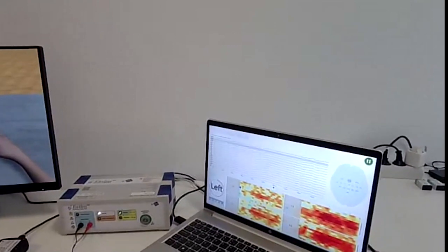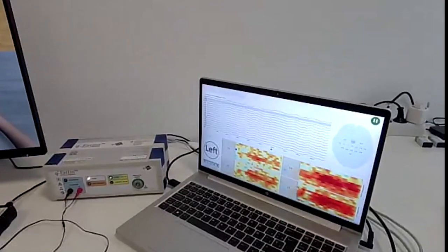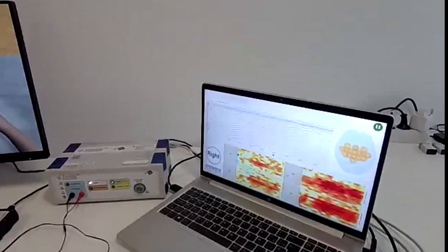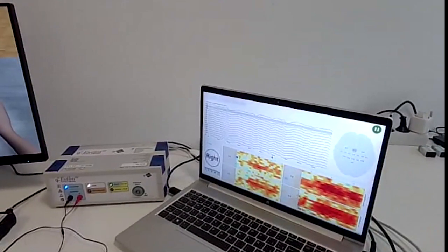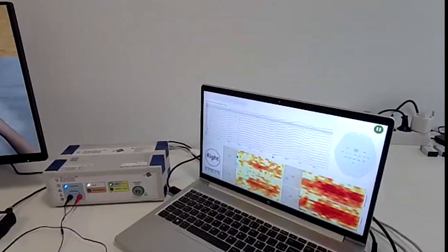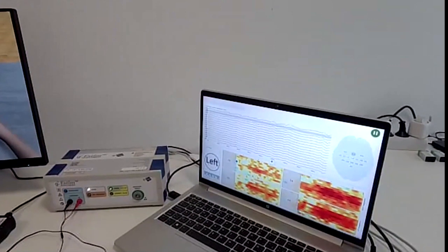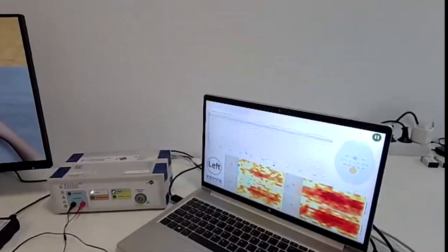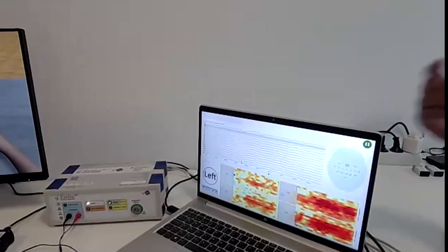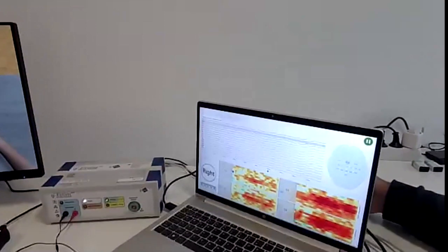There are just a few trials more to finish the run. And then after this first run is finished, the computer processes the data and tells you the motor imagination accuracy for this run. As I said before, each session is composed of 3 runs. The motor imagination accuracy is calculated after each run and takes the data from the previous runs. So every time that we calculate the motor imagery accuracy on the session, it's getting more precise because we have more data.